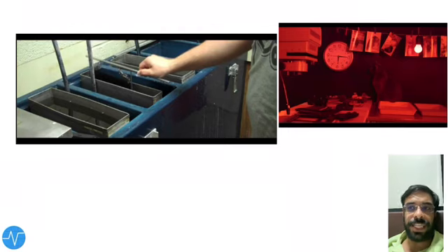The third step is fixation. Now some silver bromide will not be exposed to X-ray. This will have a detrimental effect on the image quality. Therefore we need to remove it. This is done by ammonium thiosulfate, and this process is known as fixation, which is the third container.